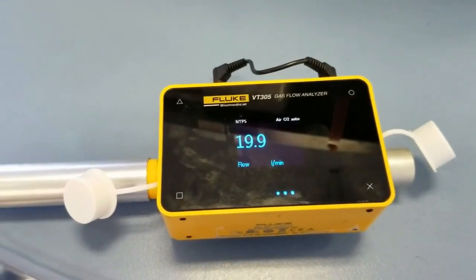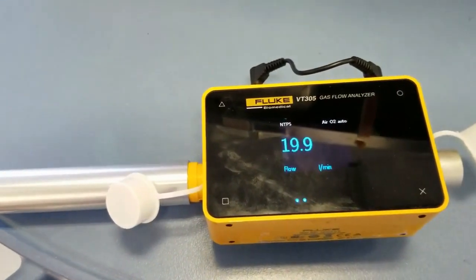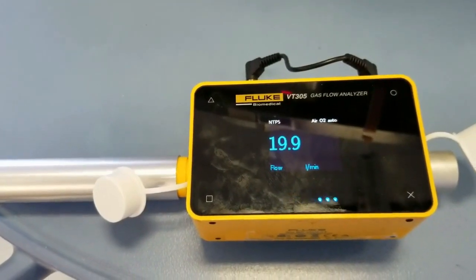On our meter, you can see we now have 20 liters a minute. If you just want to do oxygen, change your settings to oxygen only. If you want to do air only, change your settings to air only. That's simple.